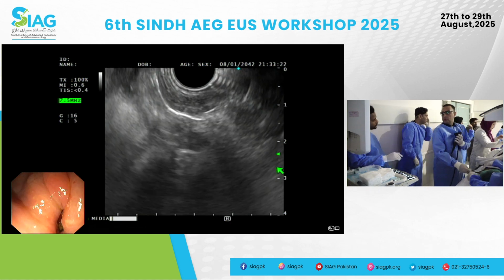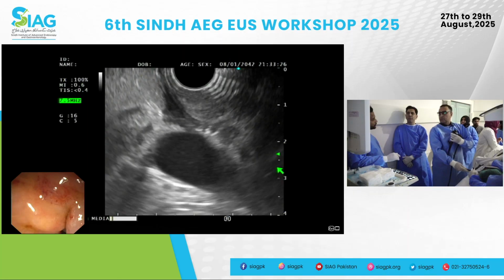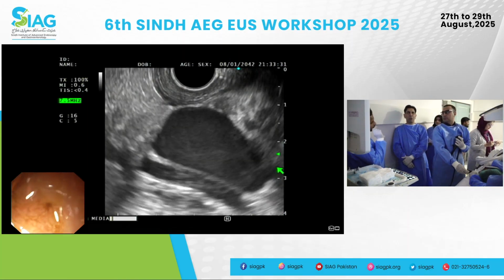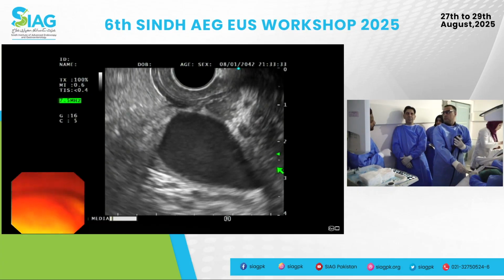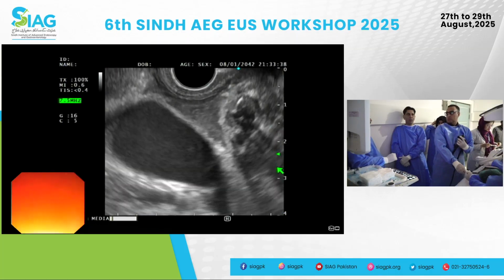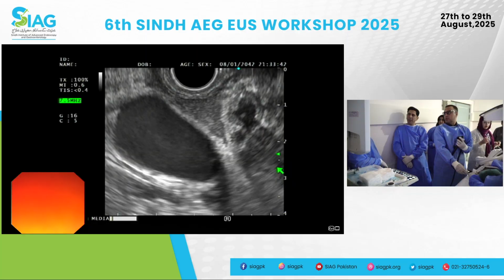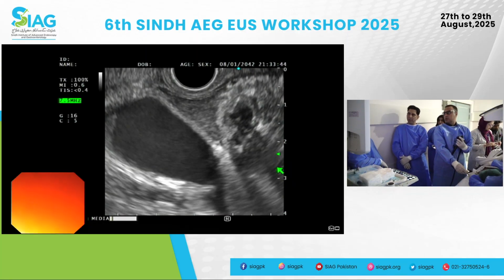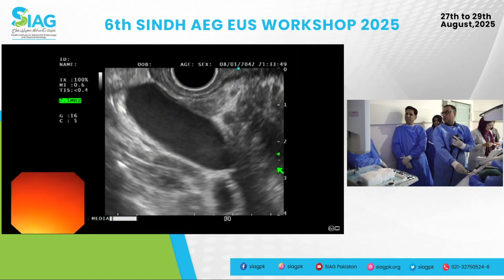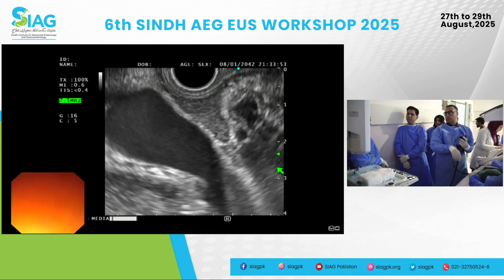Is the mic on? So this is a gentleman who had presented with painful jaundice, had an ERCP when the thought was that he had a distal CBD stricture, and a stent was placed. So are we in D1? Yeah, we are. Good, excellent. So in D1, you hopefully should be able to appreciate what Shah Yusuf is demonstrating: CBD with biliary stent in situ. So this is a patient suspected of distal CBD stricture.